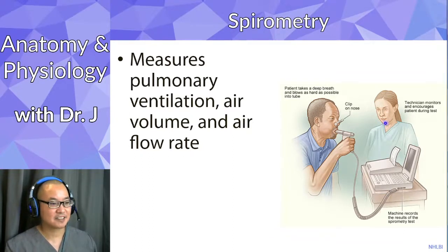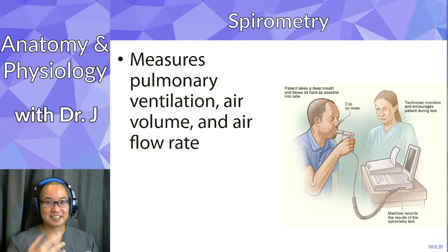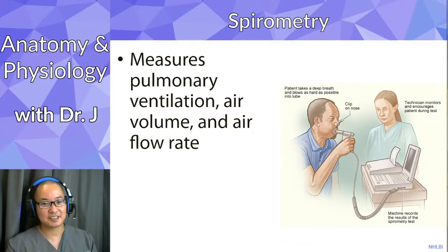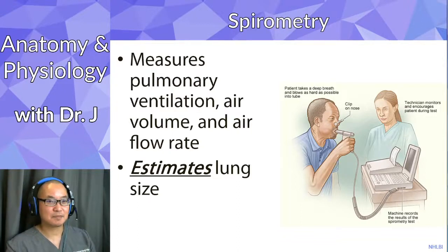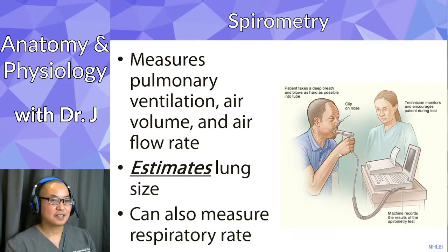And I love the way she's looking at him here, and she's also making sure he's doing it correctly, and prompting him and encouraging him to breathe normally, and also take a deep breath in, deep breath out, depending on what she wants to measure in this example. Now, it estimates lung size. I'll get to why it can't directly measure your full lung size in a few slides. And it can also measure your respiratory rate. We'll cover that at the end.